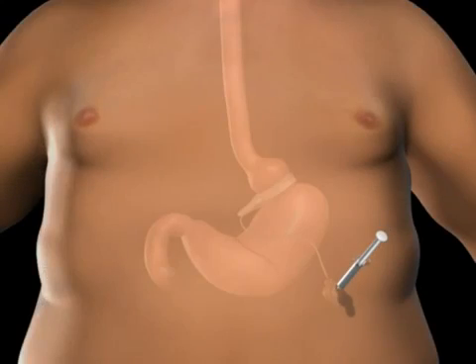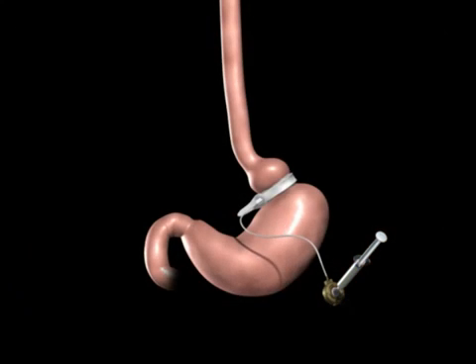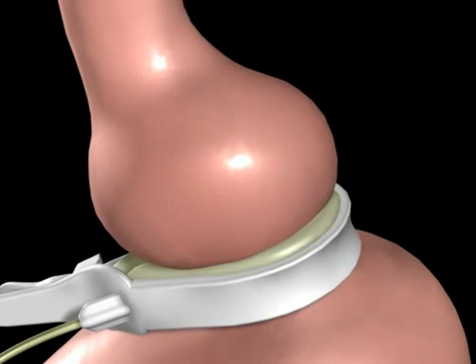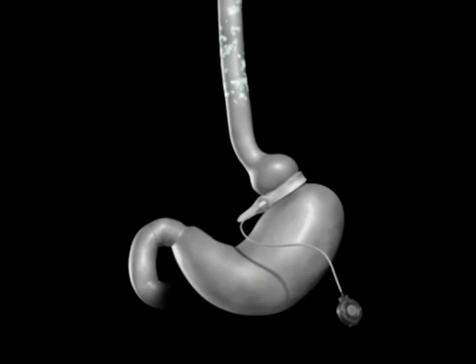Your surgeon may tighten the Realize band by injecting saline into the injection port. As the saline is introduced to the Realize injection port, it travels through the tube to the band. The addition of saline to the band creates a smaller upper stomach pouch. This smaller stomach pouch restricts the amount of food you can eat before feeling full.